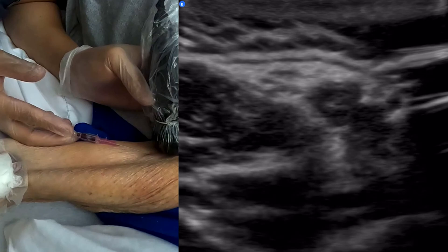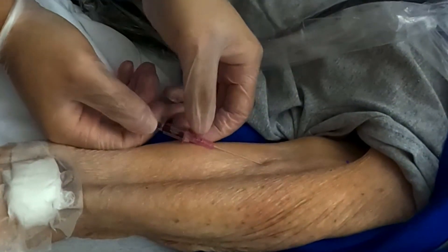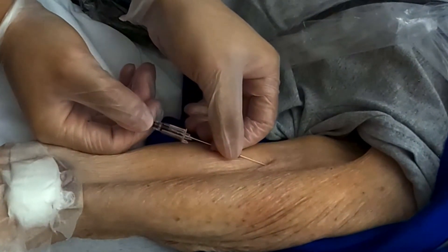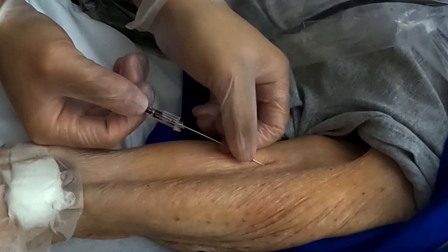Okay, good — it's opening up. Great. So now I'm going to attempt to advance the catheter. Nice and smooth, consistently smooth — no changes, no variation.